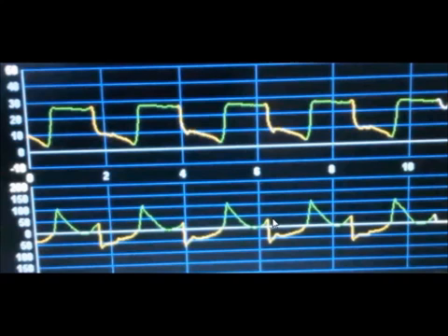Now I can't turn up my flow or anything in pressure control. The only thing I can do is increase my driving pressure or my peak inspiratory pressure setting. As you notice, we're currently at a pressure control of approximately 25. We could possibly turn it up to 30 centimeters of water and see if this relieves this flow asynchrony. So in this example, using pressure control ventilation with a patient with a huge inspiratory demand, you still may have flow asynchronies.